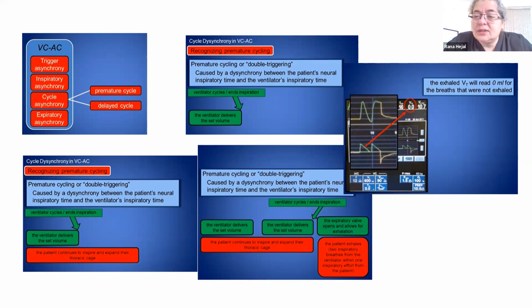So, what's the solution to this one? The solution is actually increasing the inspiratory time and/or increasing the volume. And when it comes to increasing the volume, you know that you're in trouble if somebody has ARDS; you opt not to do it and go for increasing sedation. But you have to make sure first that they have enough inspiratory time, and you try to control them that way.